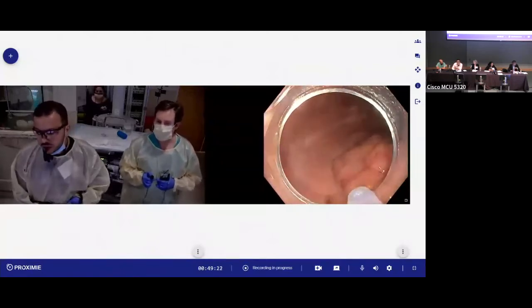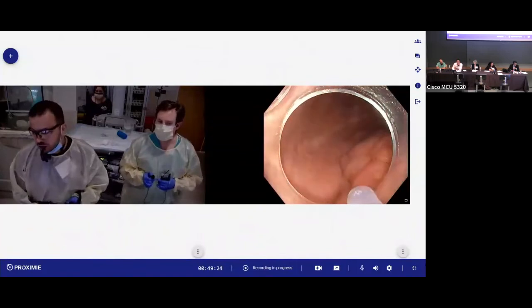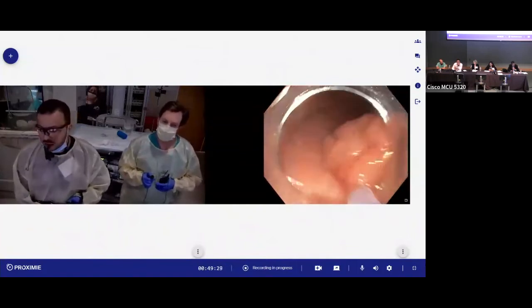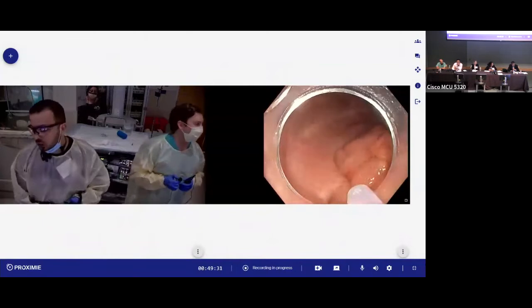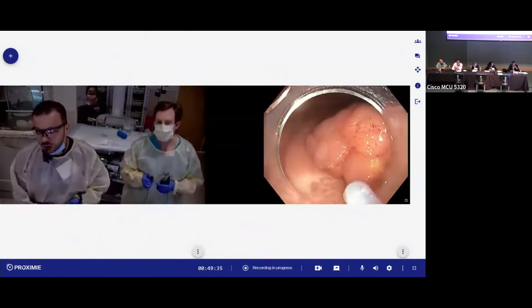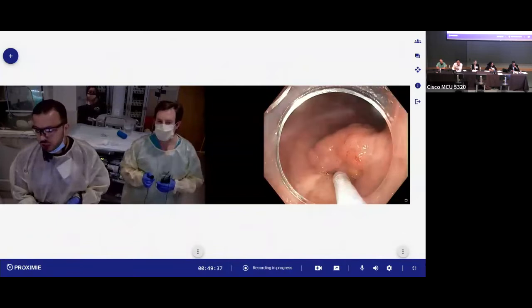We're going to proceed with injection here. We have injection of an Orise gel here. Awesome. Yeah, Hazem, I just wanted to tell you that we have another room that's ready. If you can just demonstrate lifting, then we can move to Dr. Athman's room.